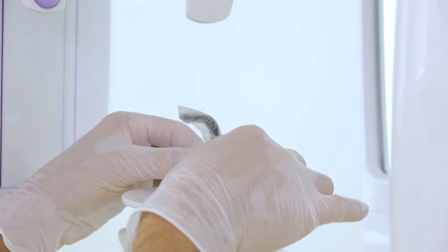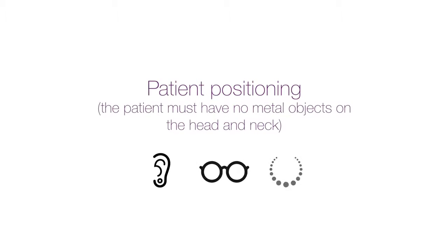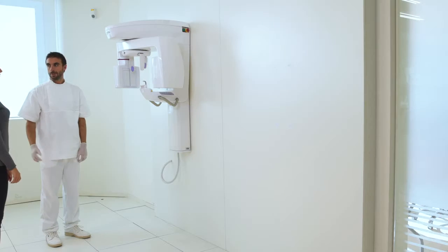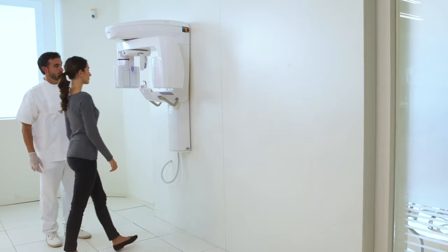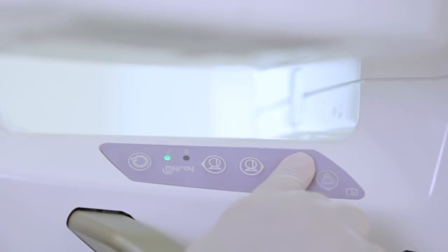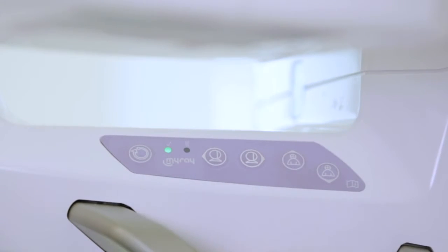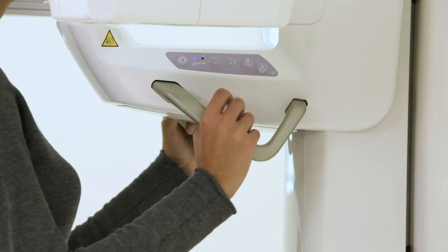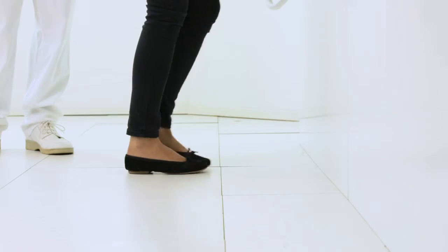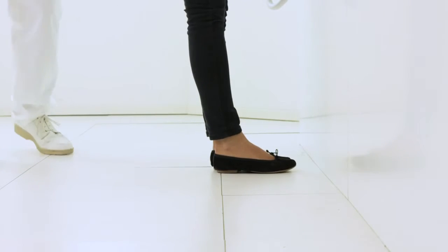For a successful X-ray scan, it is important to start by correctly positioning the patient. The first operation adjusts the height of the device. This is done from an onboard keypad. Once the correct height has been reached, the patient grabs the handles, rests her chin as required, and places her feet slightly forward with respect to her pelvis.